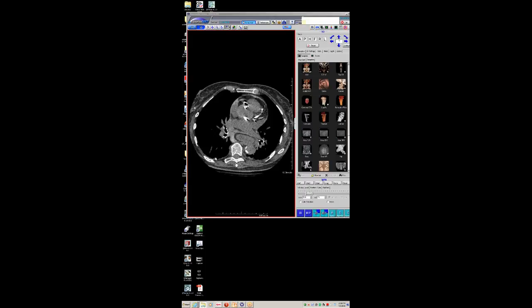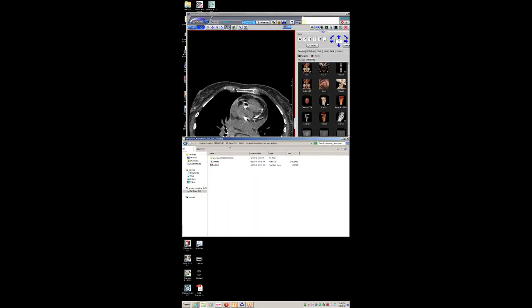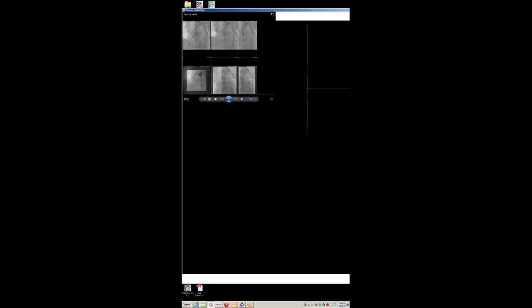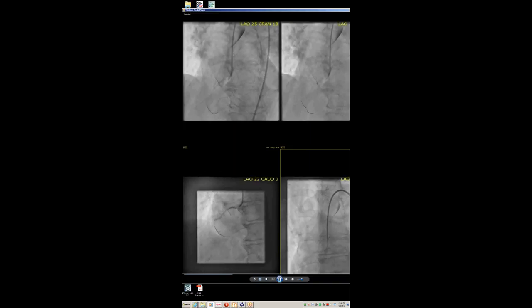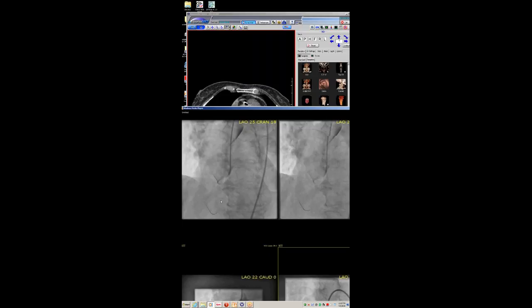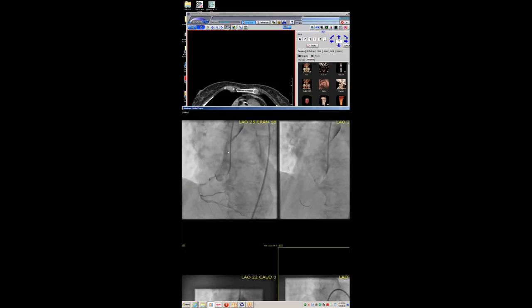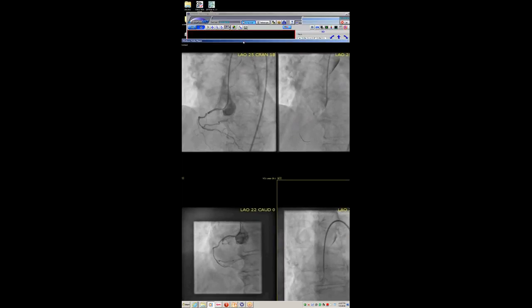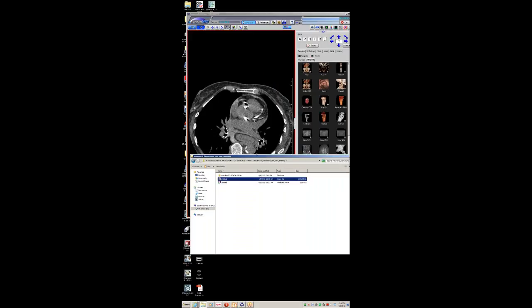It turns out this patient had a cath the other day. During the cath, they were blowing up a balloon in the ostium of the right coronary artery and noticed a coronary dissection. But what they failed to notice is that you can see contrast here — they're injecting the right coronary artery after stenting the proximal RCA for this dissection, and this contrast is pooling and doesn't go away. It's in the aorta wall, so presumably an iatrogenic intramural injury slash dissection.